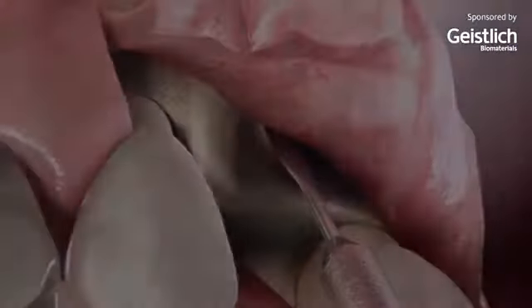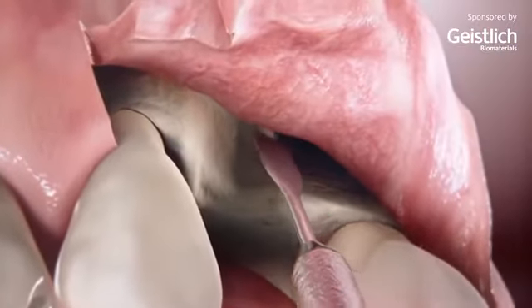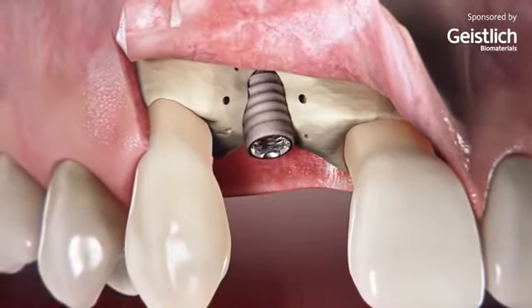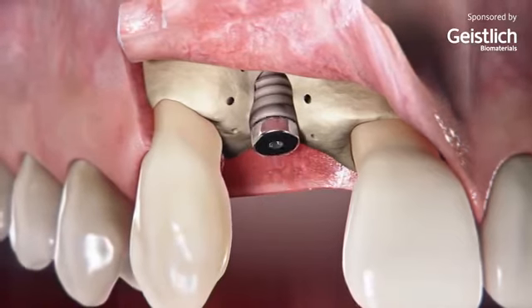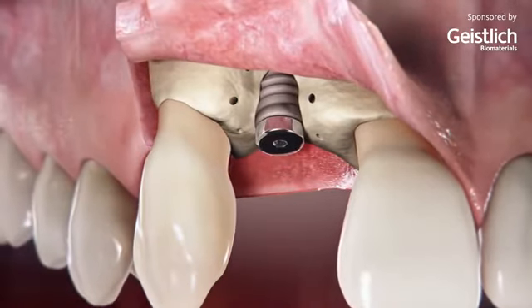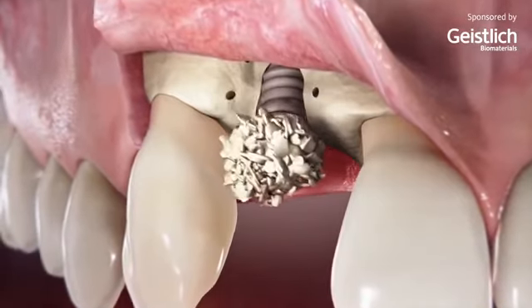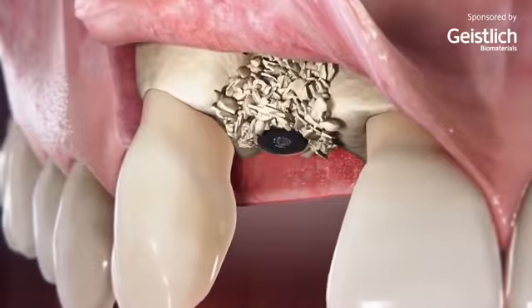The insertion of an implant requires bone regeneration. New bone formation originates from the lateral bone walls of this crater-like two-wall defect. It is supported by the applied layer of autogenous bone chips locally harvested with a bone scraper.